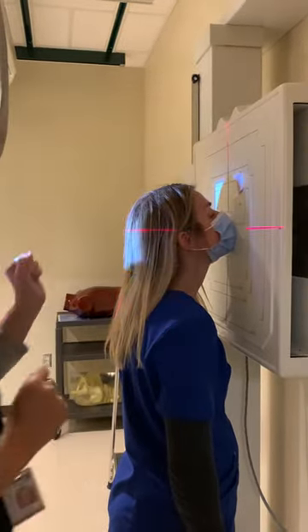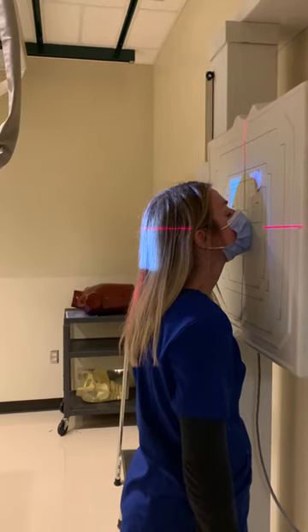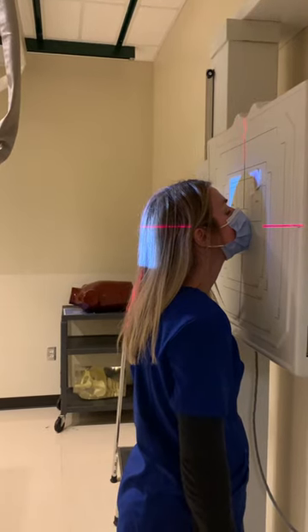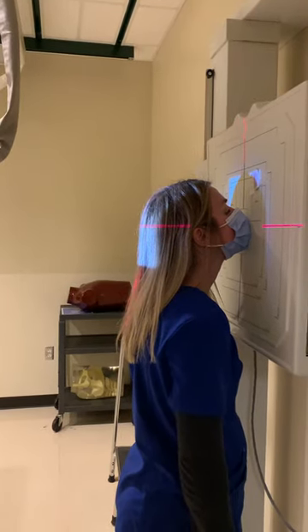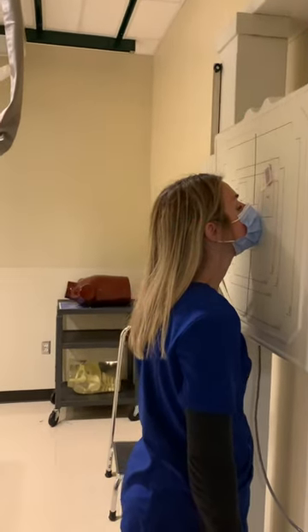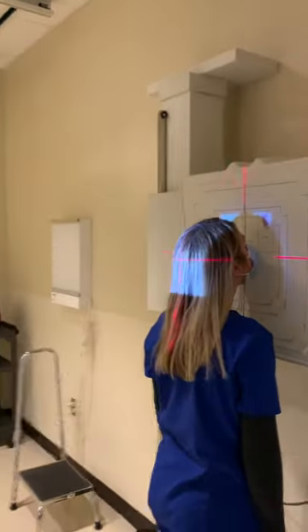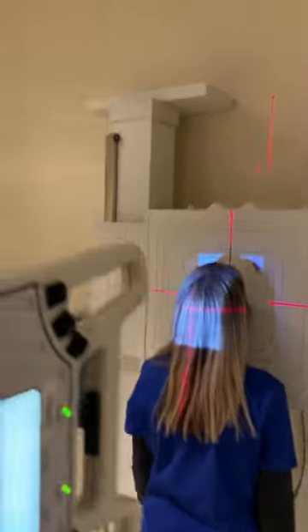We're going to adjust our collimation to approximately 8 by 10. We are putting a marker on the right side of the body. We're at 40 inches SID, and no shielding is required for these.